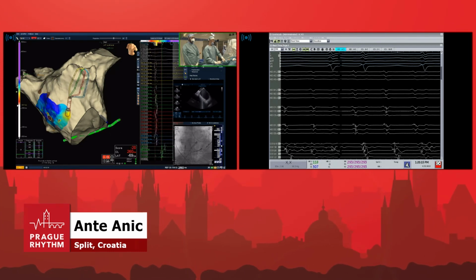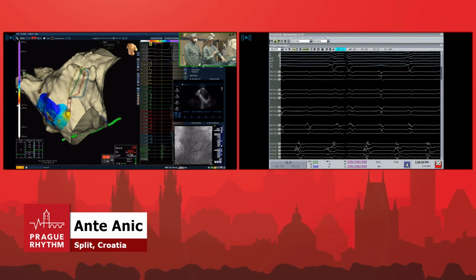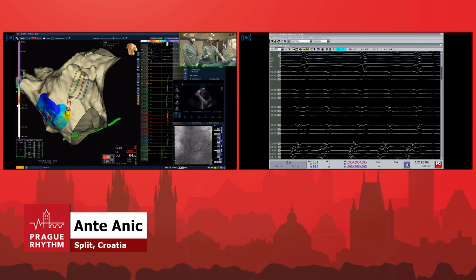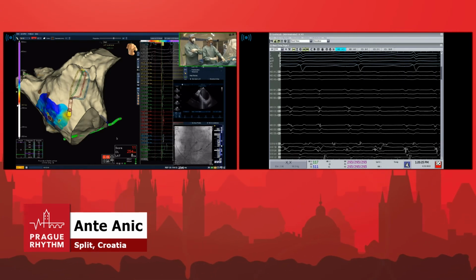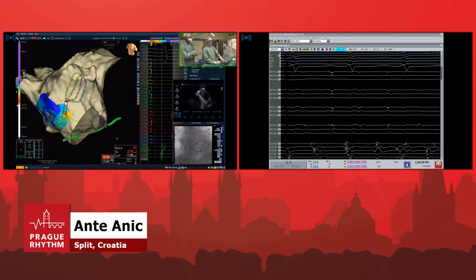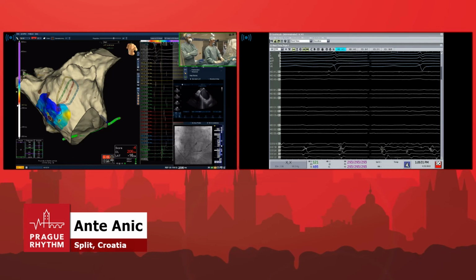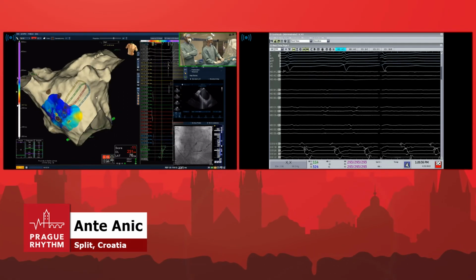It's not stable. Now, I agree with you guys. I agree that now, but see the activation on CS. It's wobbling? Yeah, it is. So now we are dealing with unstable arrhythmias. And the cycle length is, of course, like this because of... I think it's not ATAC anymore.